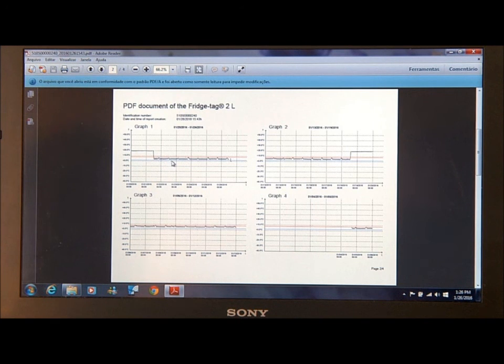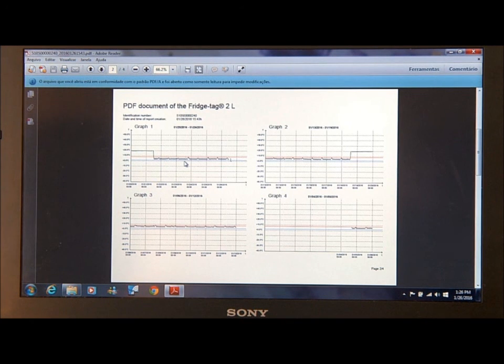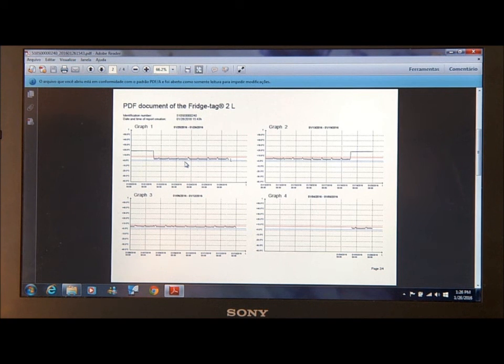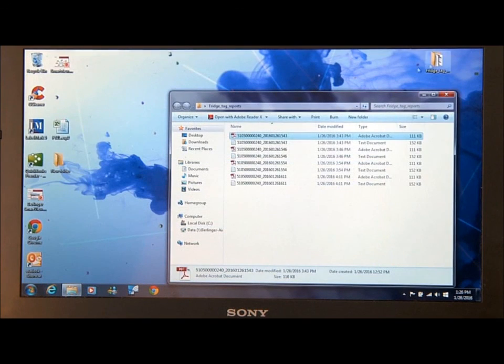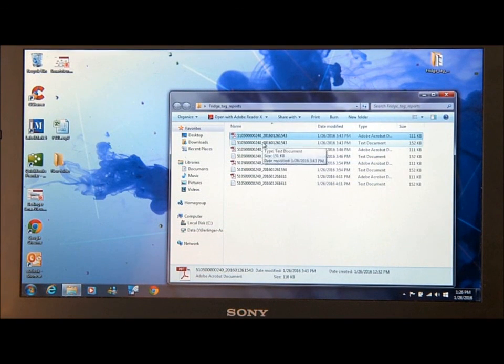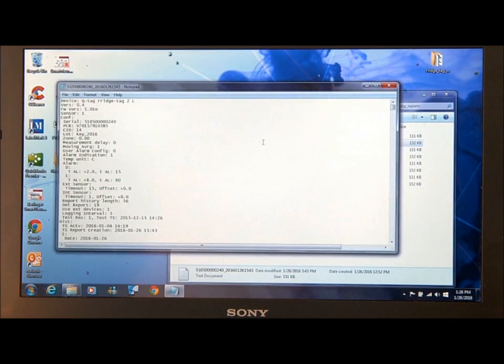This is useful if you're trying to root cause some alarms that are occurring. And if you need more data, close the PDF report and open the TXT report.